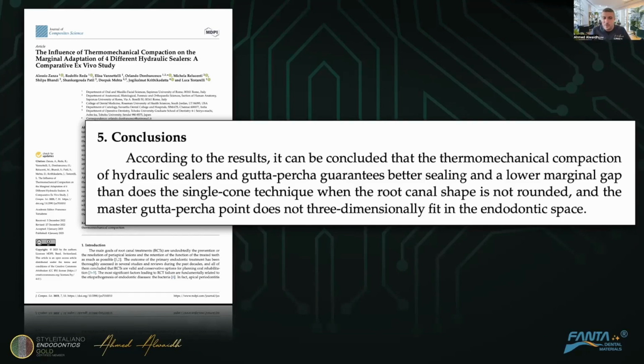And as you know, we're not dealing with round canals. It's a three-dimensional, complex system. Most of the canals are oval in the cross section, not round. And so this raises another question: how can we use heat with hydraulic obturation?